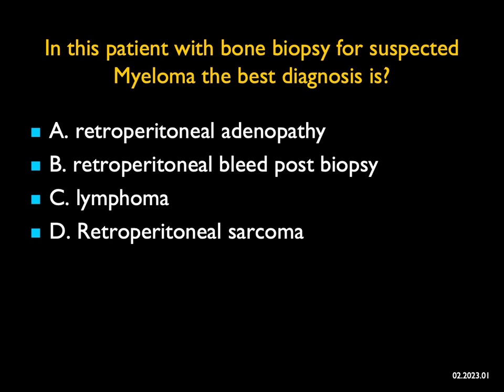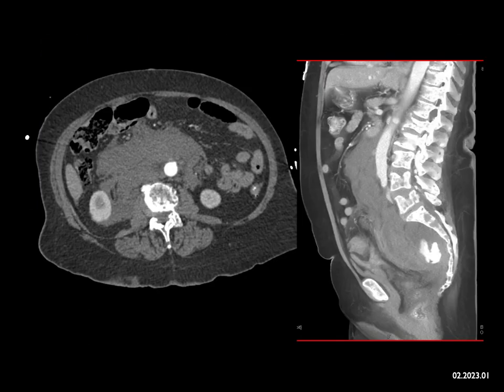In this patient with bone marrow biopsy for suspected myeloma, what's the best diagnosis? If you look at the images on the axial view, you see what looks like a large soft tissue mass in the retroperitoneum, particularly tracking on the right side greater than the left. From the sagittal view, it tracks all the way down to the patient's pelvis. You can see multiple mixed lytic and blastic lesions in the bone, most consistent with the diagnosis of myeloma.